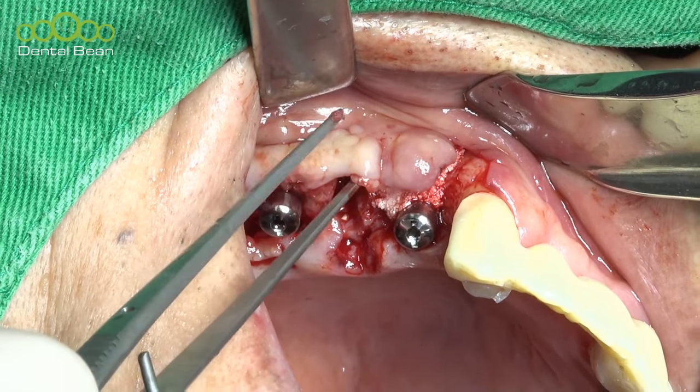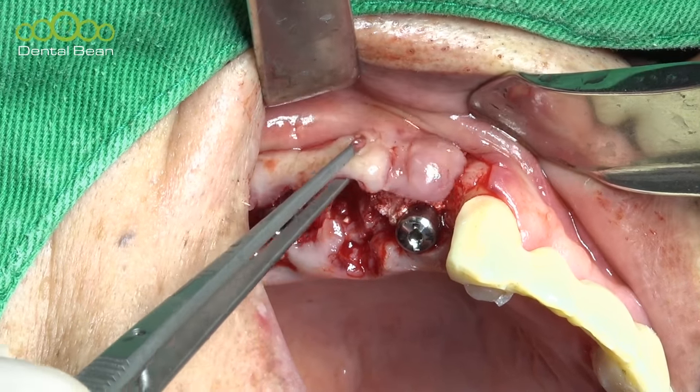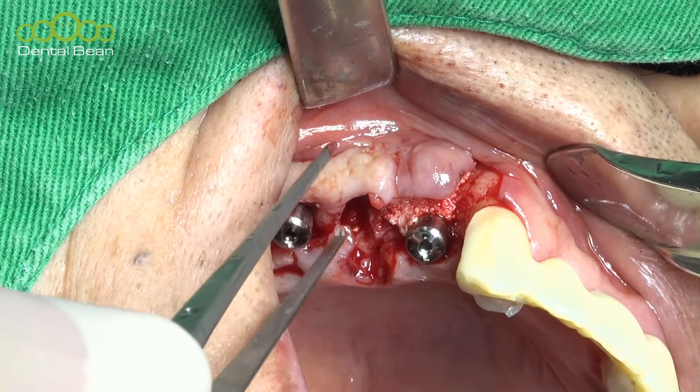Before suture, usually you can try the flap approximation. In this area, no tension releasing, no more vertical incision. So the flap closure is very easy at this time.